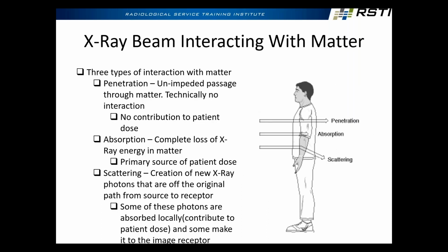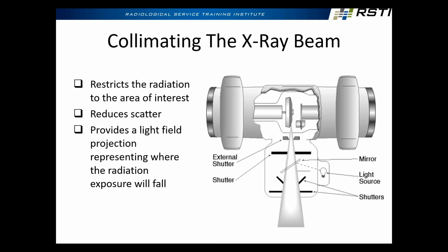Right? Oh, where'd I go? There we go. So the collimator, we said the collimator was a beam limiting device. The whole idea here is that we want to restrict the X-ray beam to the area of our image receptor. We mentioned the term PBL collimator last hour, and I just briefly said it. PBL means positive beam limitation. Fancy way to say an automatic collimator. It'll automatically size to the size of our image receptor under certain conditions, right?